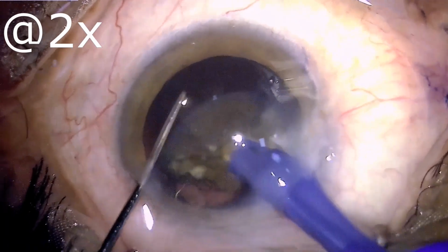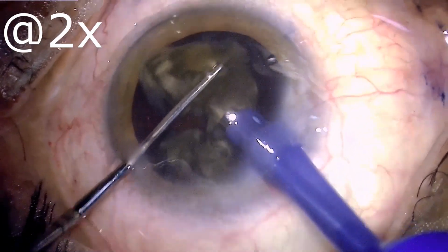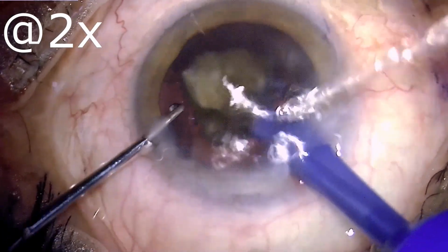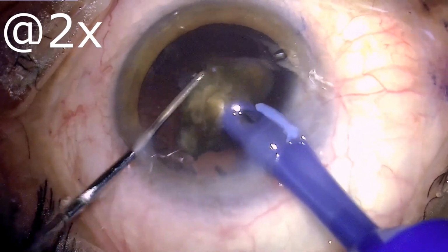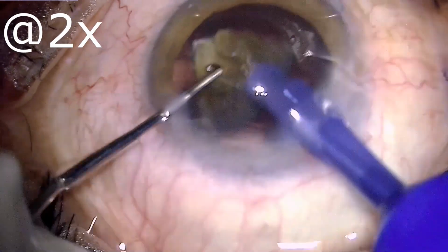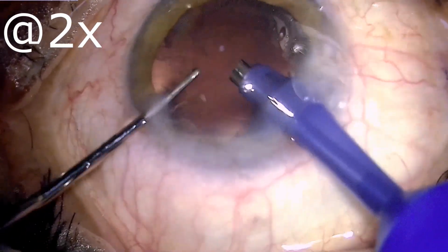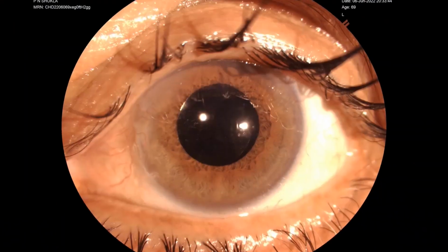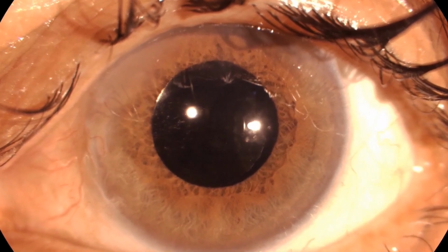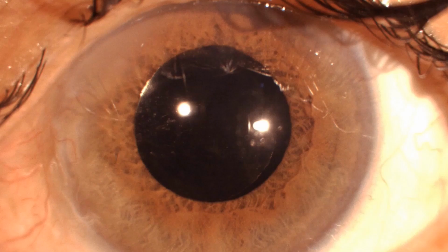Another important thing is to create more than 4 pieces so as to have chunks which are smaller and don't protrude into the anterior chamber or come close to the corneal endothelium, if one wants to avoid post-operative corneal decompensation. And this is the patient at day 1 post-op, where we can appreciate a clear cornea and the visual acuity which was 6 by 12.